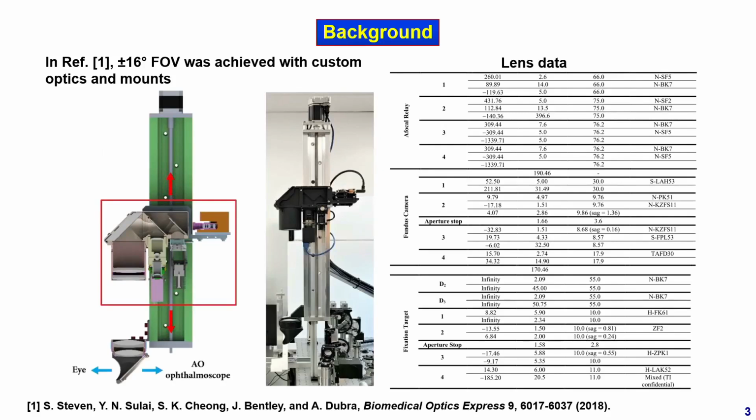The previous work I mentioned employed custom optics and mounts, so the cost and lead time can be high. The field of view is also insufficient for many applications. Here we use stock lenses and achieve a larger field of view.